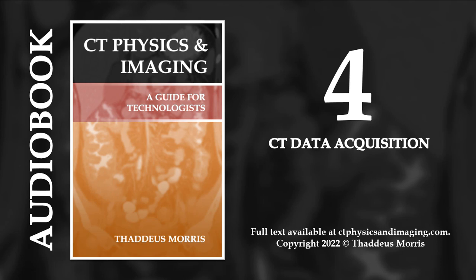The data produced by a CT scan is actually one large cylinder of data divided into tiny cubes of information called voxels, a volume pixel. Each voxel represents a very specific point in the patient that can be identified by its location in each of these axes. The z-axis location represents the specific slice, and the x and y coordinates represent the location within the slice.